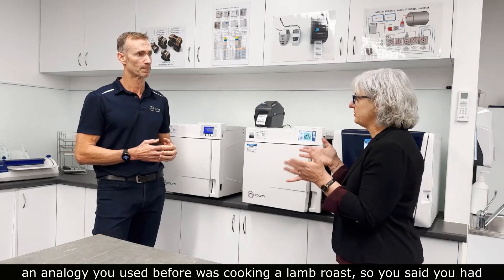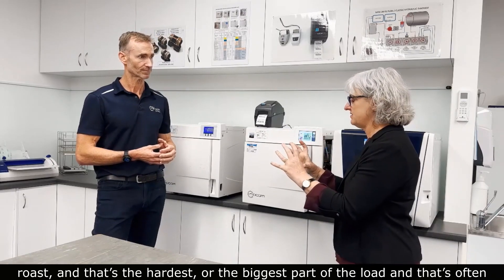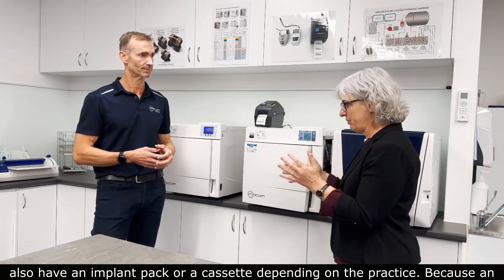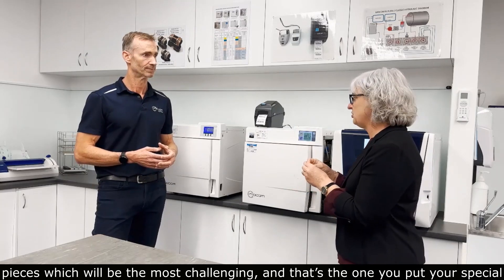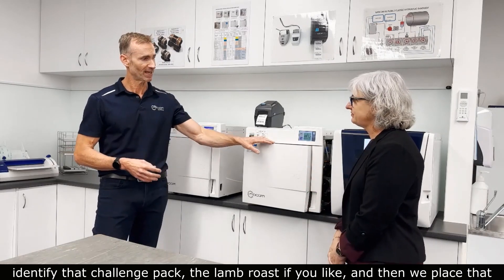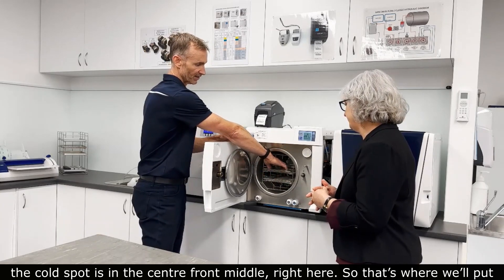An analogy used before was cooking a lamb roast — you have potatoes and all the other bits and pieces around it, but the lamb roast is the hardest or biggest part of the load, and that's what you check with a probe to make sure it's cooked. Similarly here, you might have all the smaller instruments around, but you'll also have an implant pack or a cassette, or for an orthodontic practice perhaps just handpieces — whichever is the most challenging. That's the one where we place our special temperature equipment. Within that reference load, we identify that challenge pack — the lamb roast — and place it in the coolest part of the chamber. In this particular machine, the cold spot is in the centre front middle, so that's where we put the challenge pack.